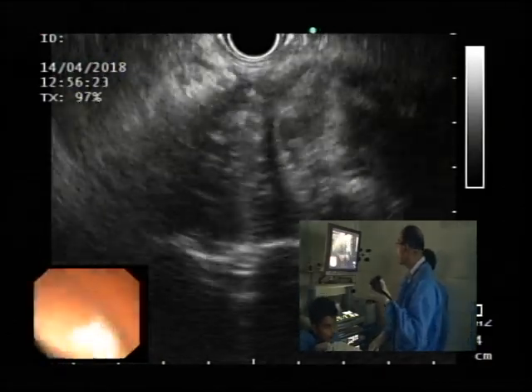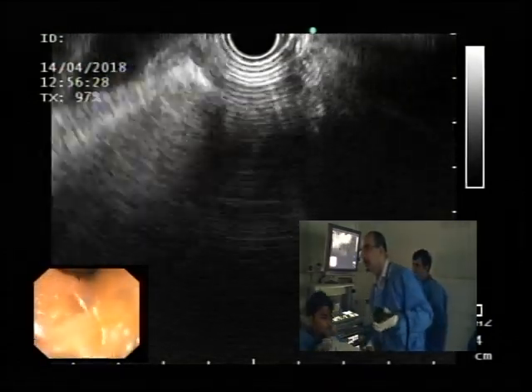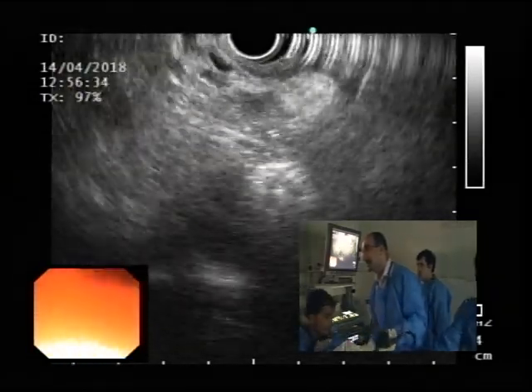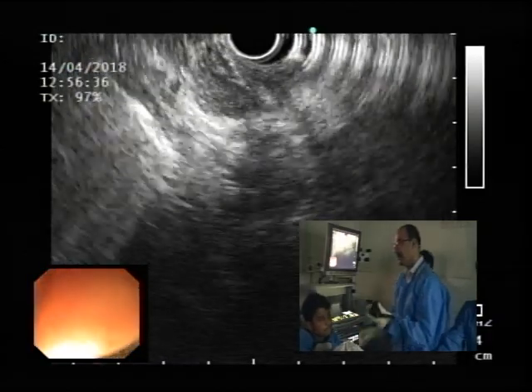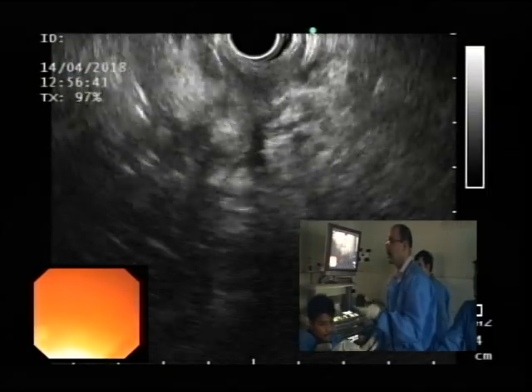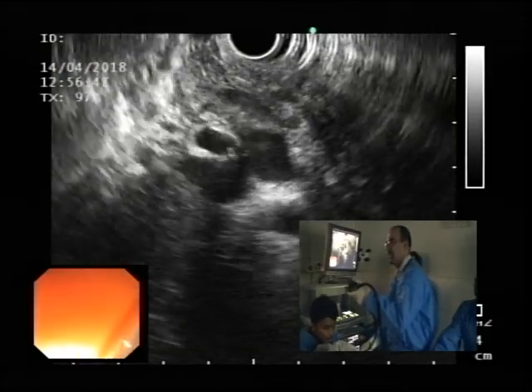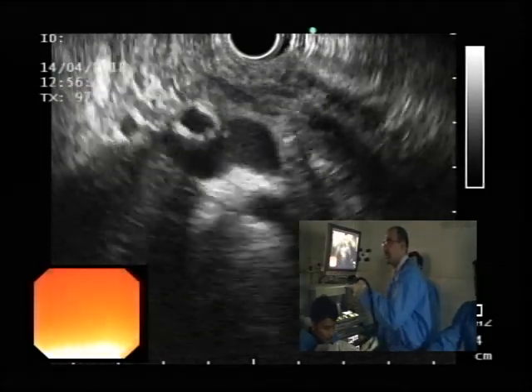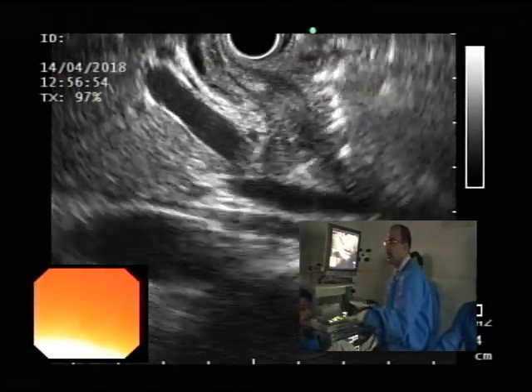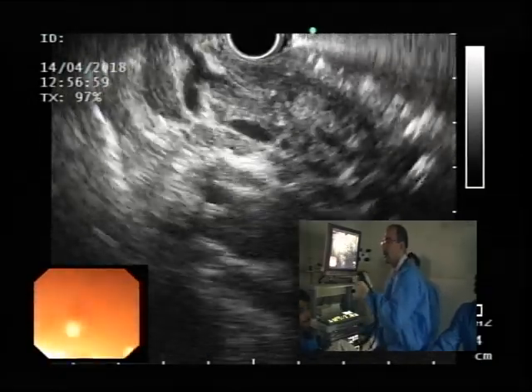Are you still there? Yeah. Any other thoughts, Khaled, or anybody else? I'll try from the bulb one last time because it's frustrating that it isn't as helpful a view for us. Earlier you thought there was a dilated duct from the gastric body, from the stomach. Can you bring that up again? Yeah, let me try that, because maybe the structure that looked like a vessel from there was the same structure we saw from the stomach. Okay, sure.